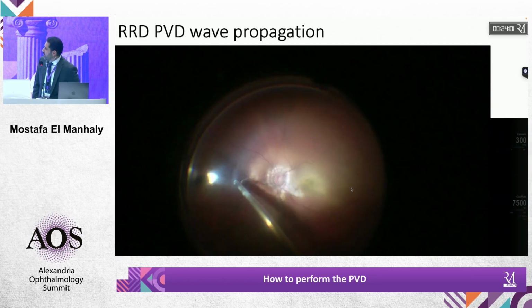Well, in pediatric retinal detachment, you cannot predict the behavior of the posterior hyaloid before going inside the eye. In some cases, but not in Stickler syndrome, the posterior hyaloid can be detached easily. In others, as in Dr. Hany's case, it is strongly adherent. I also go for the bimanual technique, using two forceps, or forceps and the cutter.